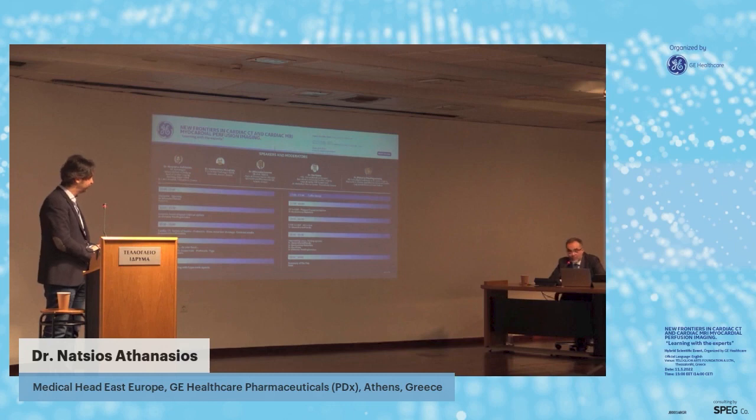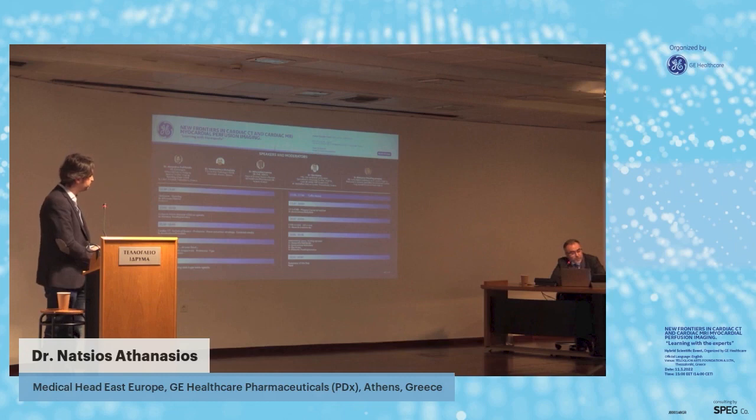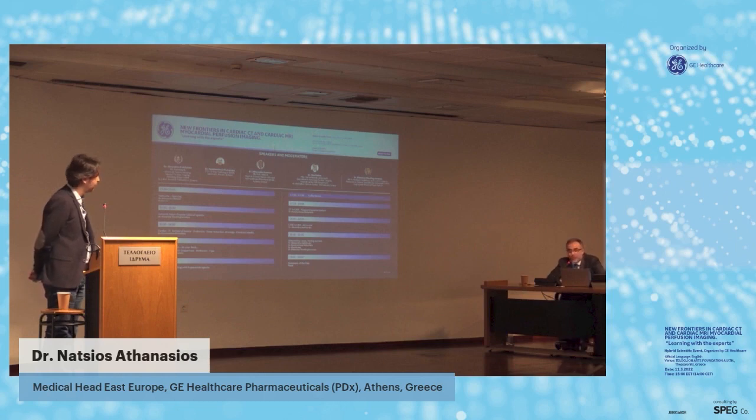Yeah, correct. I fully agree with you. The second question asks, could stress MRI be performed in patients with advanced cardiac failure? Actually, if we have a very low ejection fraction, it is preferable to avoid the stress situation. And of course, if we have a very acute infarction, it is important to have a stable patient in order to proceed with this approach. I don't know if Ilias has something to add about this. Okay, I think that it is a common opinion. Exactly, I also agree with you.